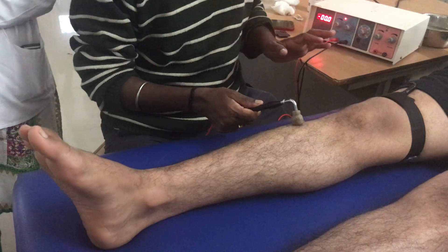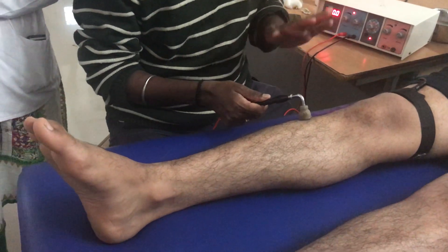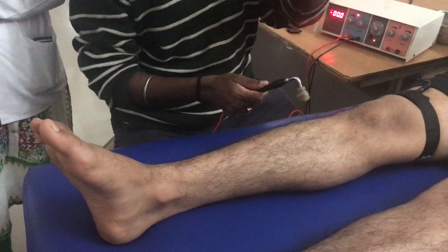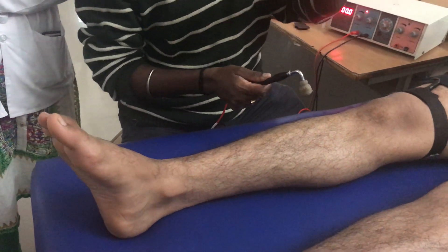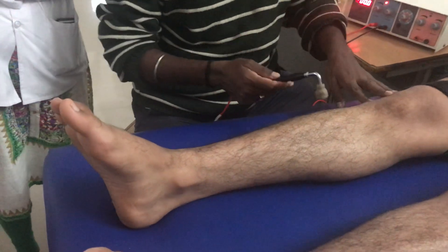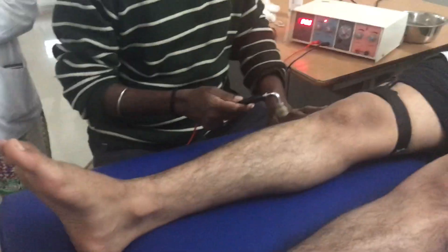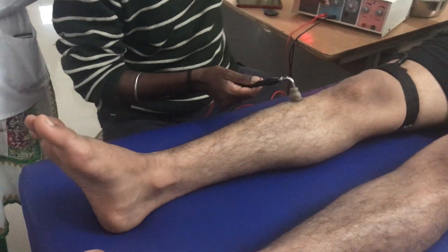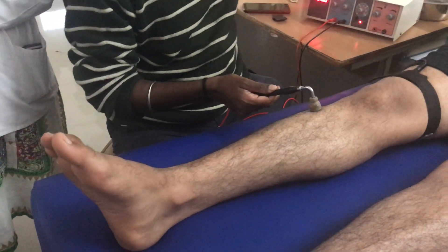The reason to mark the motor point is that when you are multitasking with the different pulse duration, intensity, and noting down the intensity, you are likely to miss the motor point. If you miss it and go a little bit here and there, you may get a contraction, but the intensity required to stimulate will vary. That is why for initial times it is okay to mark the motor point and then start to stimulate.